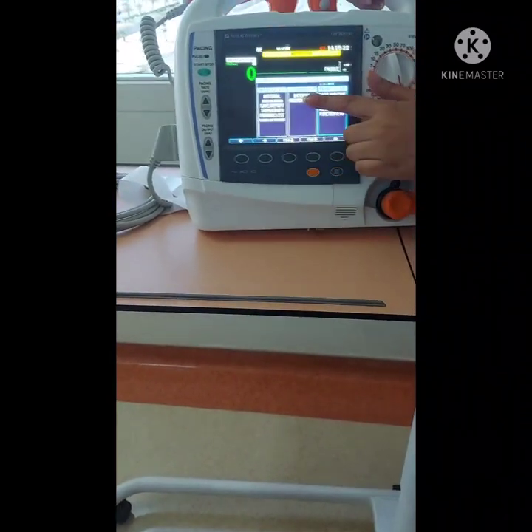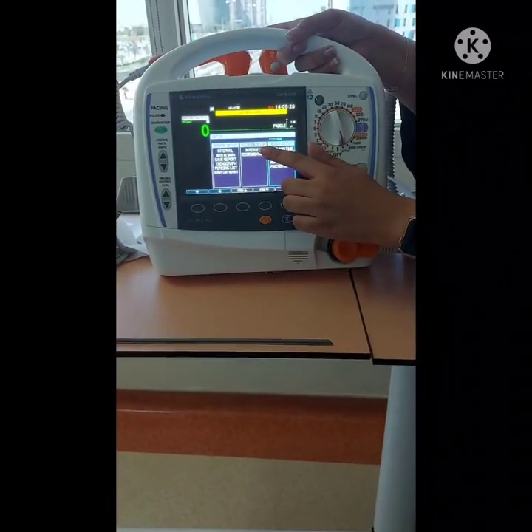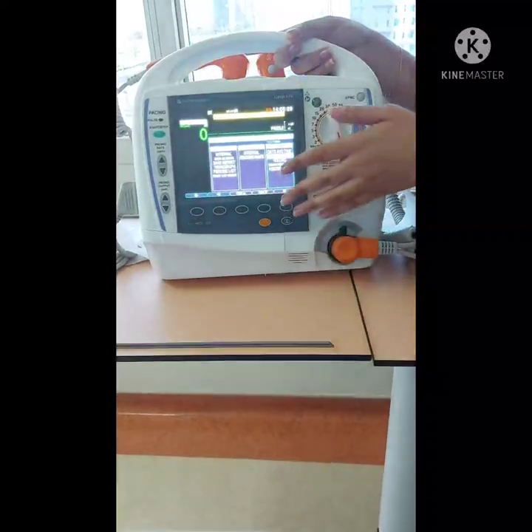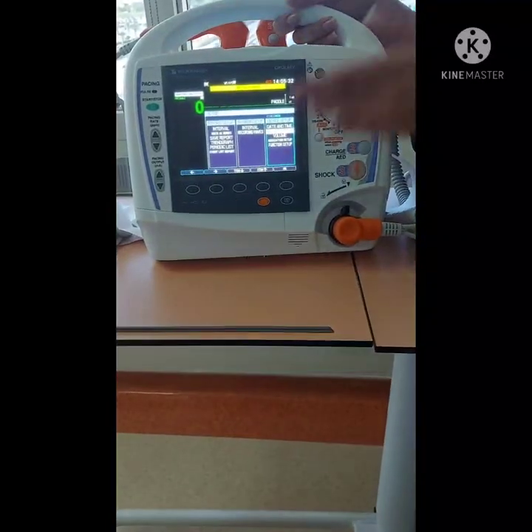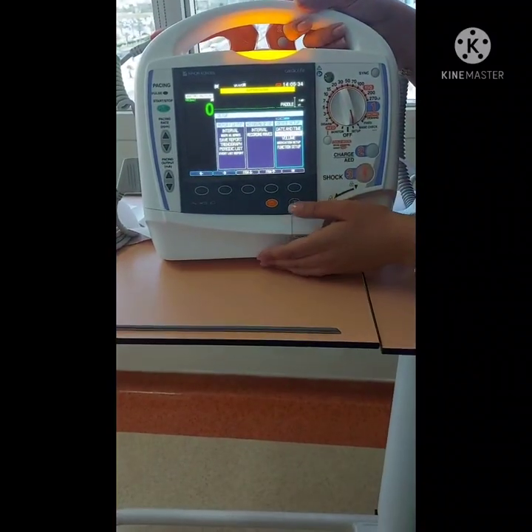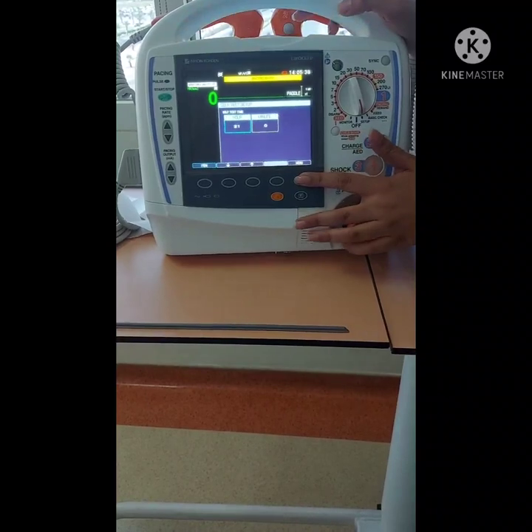Even if it's on. You can choose the recording setup, the interval, and everything from here also. So this is basically all the details for the doctor to decide what they want specifically to be printed or the shock delivered or everything. Okay, I'm gonna just go out.